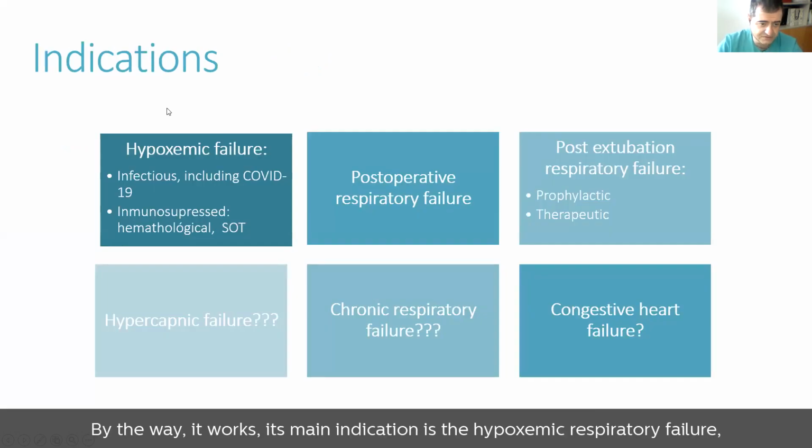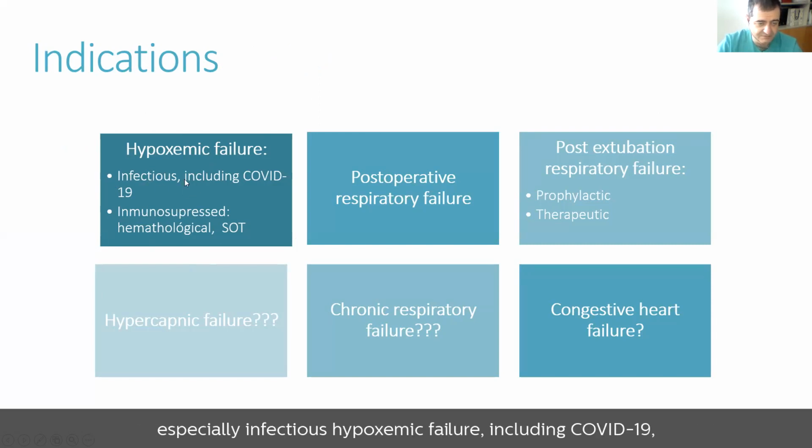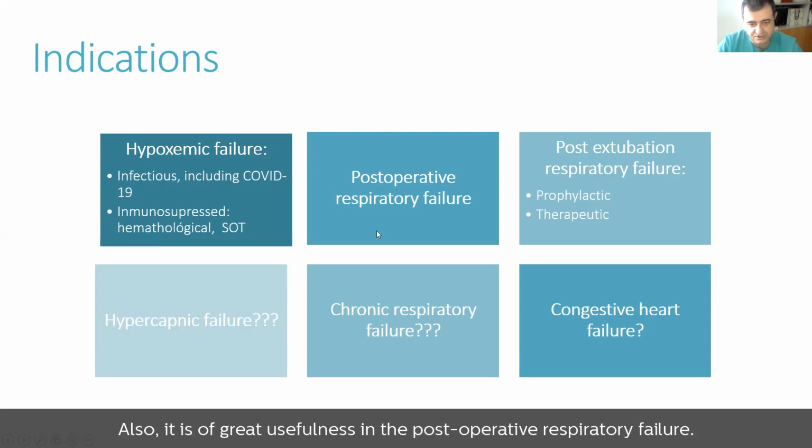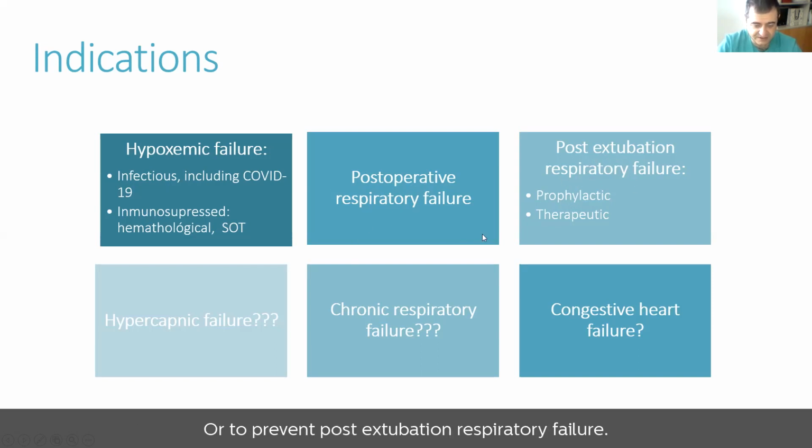By the way it works, its main indication is hypoxemic respiratory failure, especially infectious hypoxemic failure, including COVID-19, or in immunosuppressed patients, such as hematological or solid organ transplantation. Also, it is of great usefulness in postoperative respiratory failure or to prevent post-extubation respiratory failure.